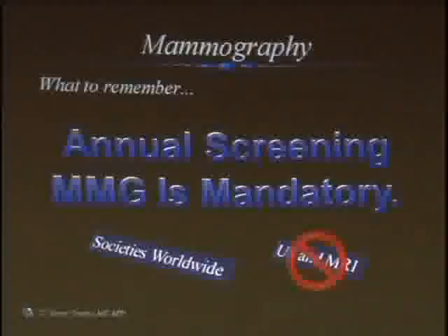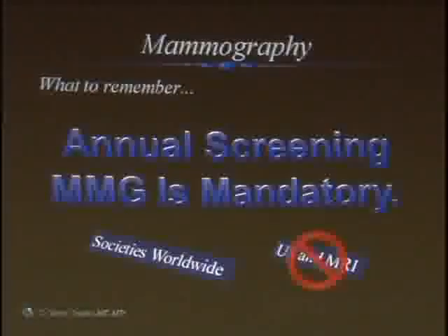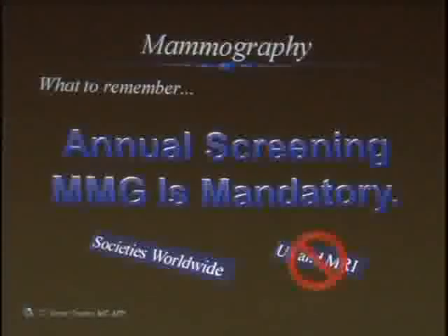Societies worldwide endorse this. Now, despite what you may have heard in the lay press and from your patients, ultrasound and MRI are not a replacement for this. Even if your patient says, I can't stand having my breast squeezed, I'm not doing it, you have to do your best to talk them into it, because the data that supports a change in mortality is only there for mammography. It is not there for these tests. These are not a replacement, and every international society says so. It is not a replacement. Mammography goes on every year without fail.